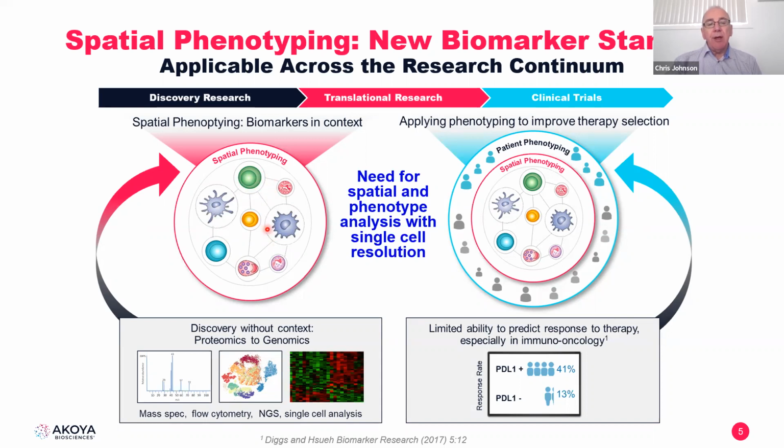The importance of this is, as we move towards precision medicine, we want to be able to use this information to get a better understanding or stratification of patients, so that they can get a better response to some of the therapies that are available, a more precise prescription in terms of the actual needs of the therapy for the disease they have. So the importance of spatial information, particularly down to the single cell, is really quite important now. And this is why we're finding that techniques like multiplexing are really quite important in this pursuit.